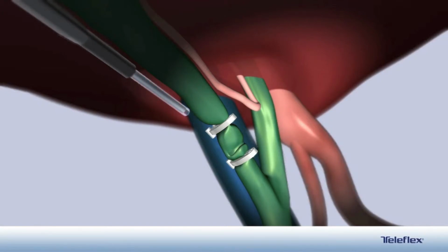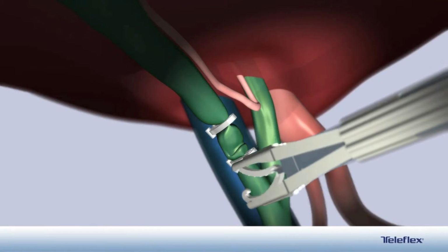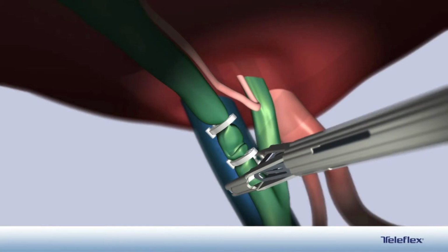One additional clip is placed across the cystic duct proximal to the previous clip on the patient's side. Note the Hem-o-lok clip is loaded into the jaw of the applier prior to surrounding the structure.